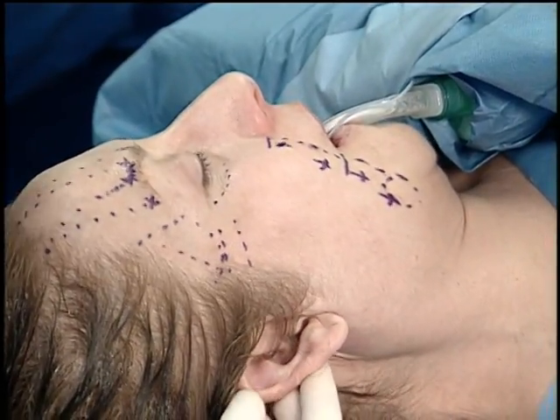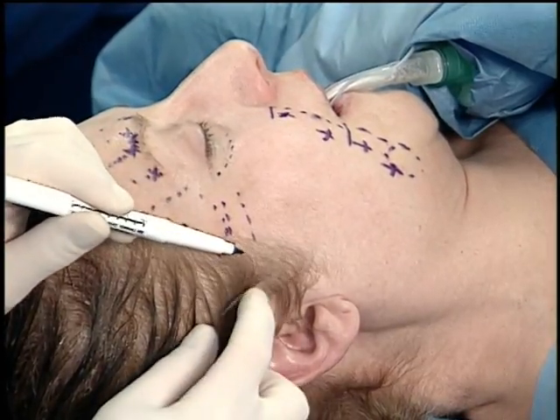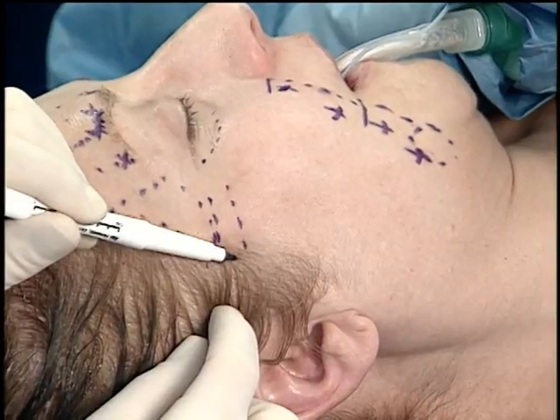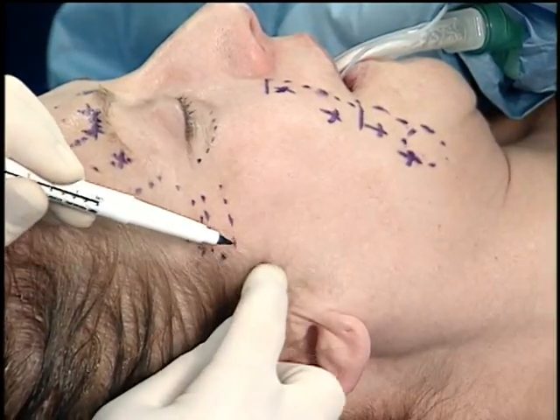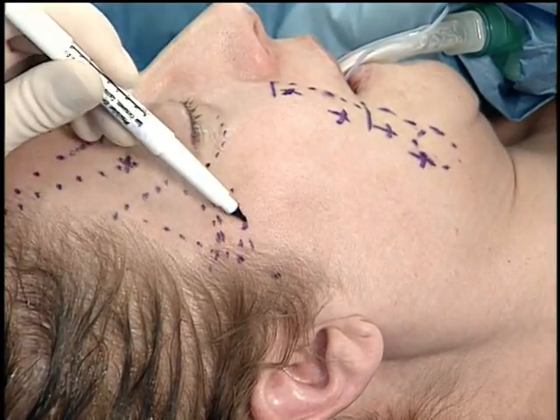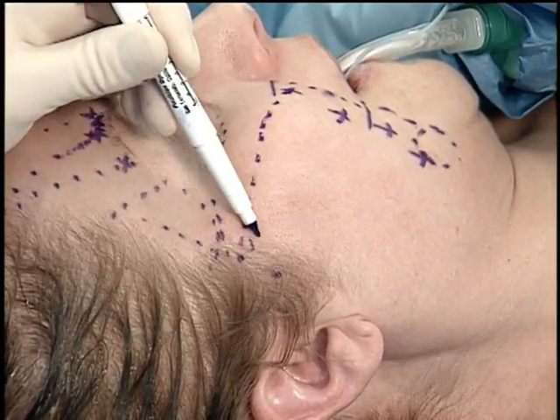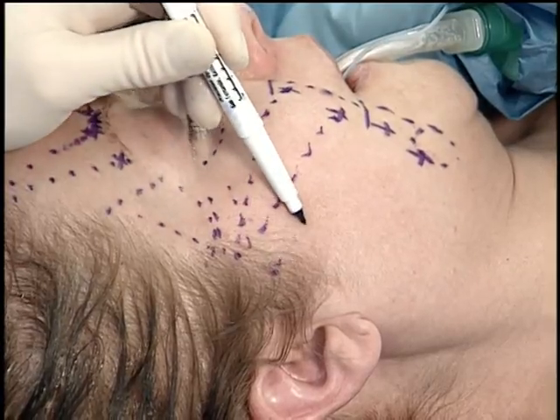We now need to deploy an anchor. We want to pick the temporal tuft as our zone. So we have a deployment port and an anchor port. And these 2 contour articulus threads will come out onto the face as such, and same from this port.